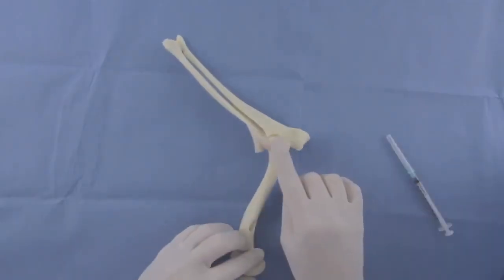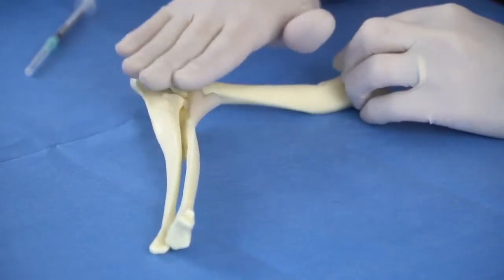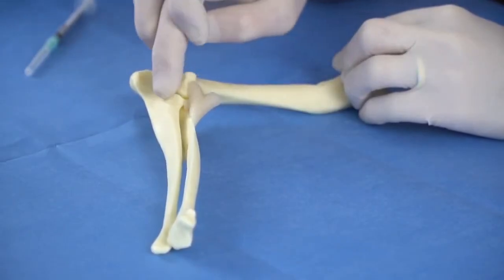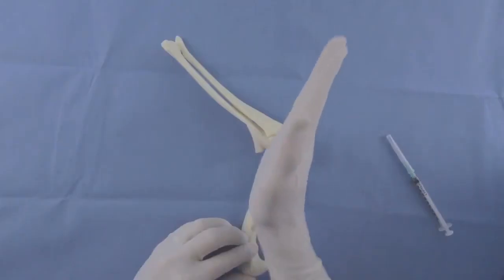First approach. Locate the epicondyle. Flattening your fingers can aid with palpation. The injection site is distal to the epicondyle.